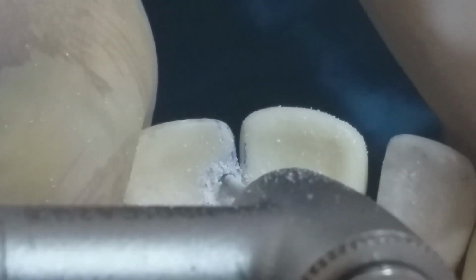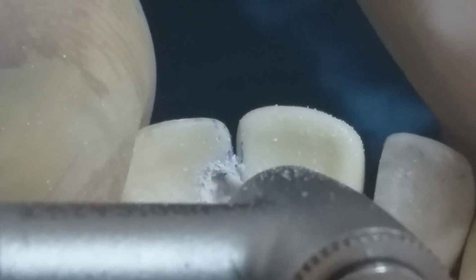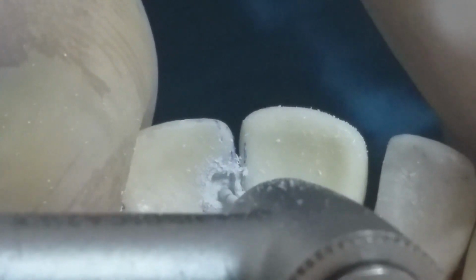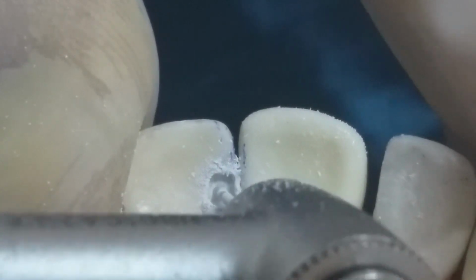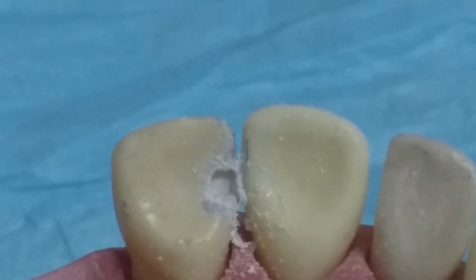And finally we have a weak tooth structure between both teeth. Still have to work, but we surely finish this.